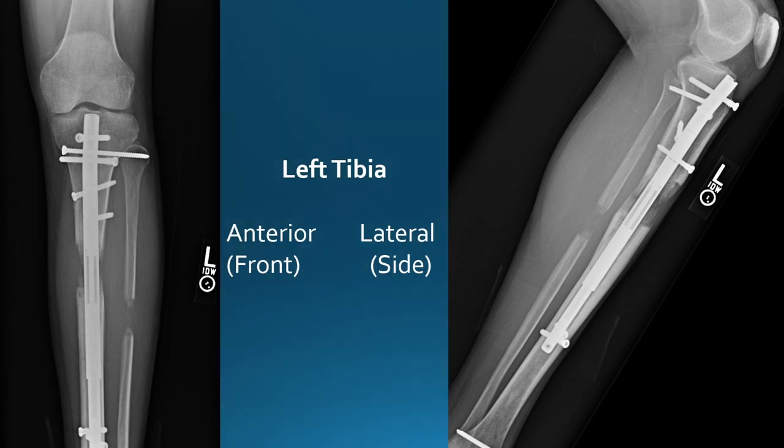Let's start off with my left tibia. Before analyzing the bone consolidation, another important part to analyze is the hardware, such as the precise nail and all the screws. Because if there may be bending or cracking in the nail or the screws may be bending, that can lead to some serious troubles. You can see the nail and the screws are fine, both from the front side, the anterior side, and the lateral side.